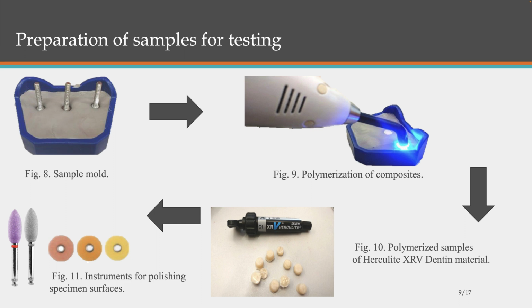After polymerizing the samples, they were subjected to abrasive treatment by grinding manually on sandpaper. The samples prepared in this way were divided into 5 groups, in which 3 samples of each group were subjected to a different surface polishing process. Purple silicone rubber polishers and others, gray, yellow, orange, brown. Also the Soflex type processing discs were used for the surface preparation.